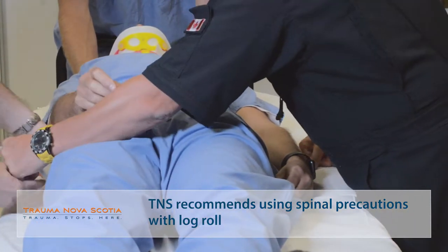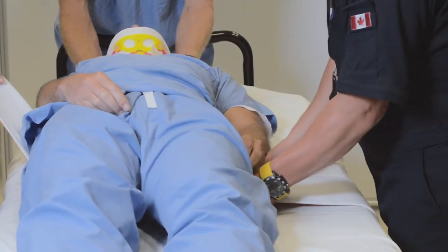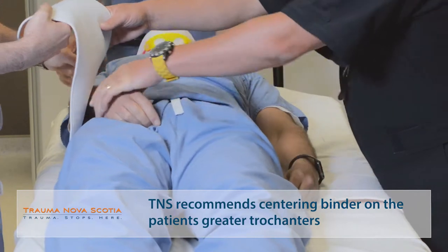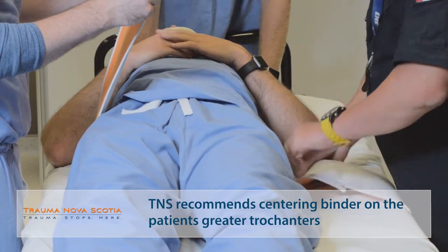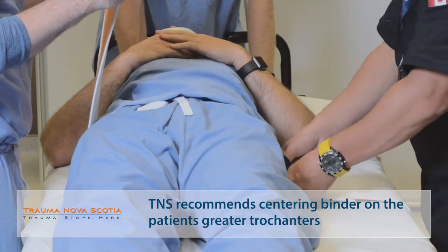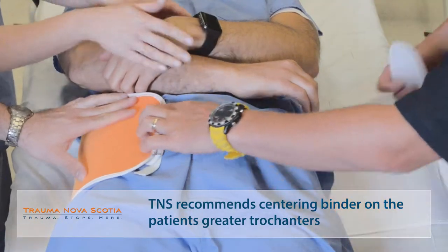Jason, pull that binder through. We want to get this binder so that the top edge is just at the level of the iliac crest, or you can also center it on the greater trochanters of the pelvis. Pull this through just a little bit — good.